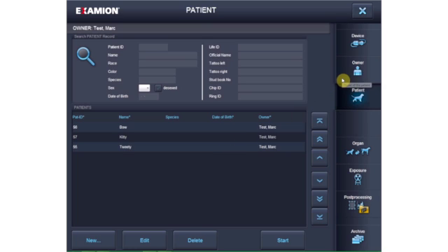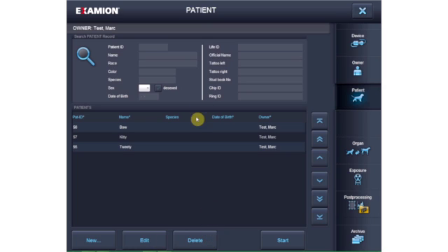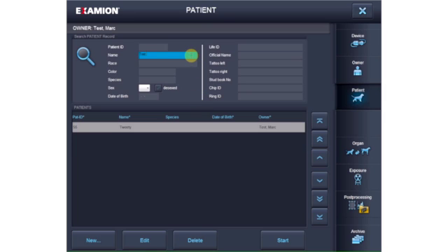In the next step, you select the patient. As many patients as needed can be assigned to the same owner. As in every other practice management program, in Examion AQS patient and owner data can be created, modified, added to and deleted. To find an owner or patient, just enter the data into the available search fields.